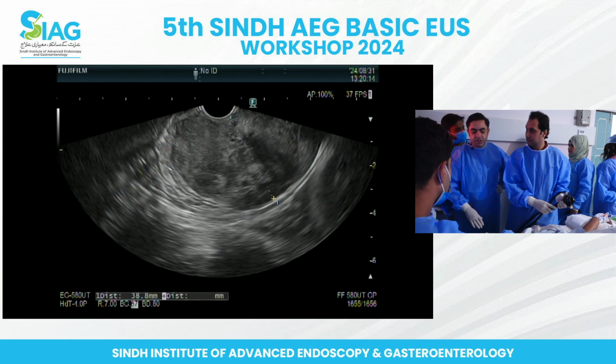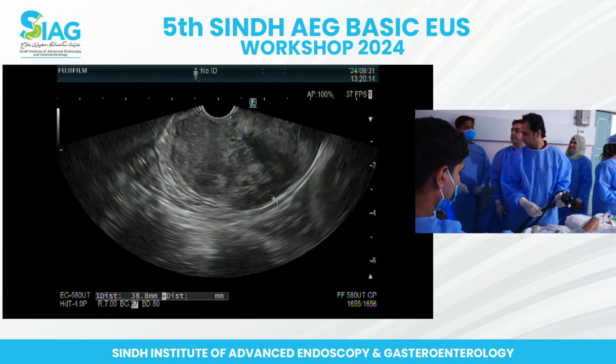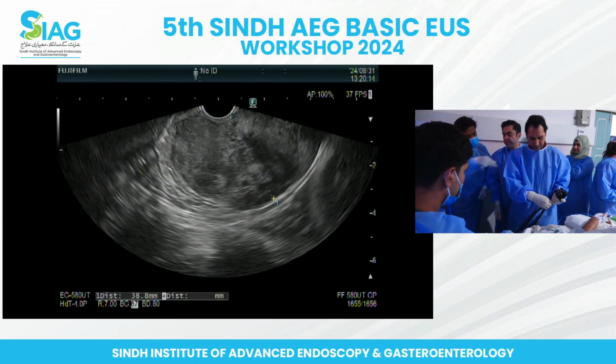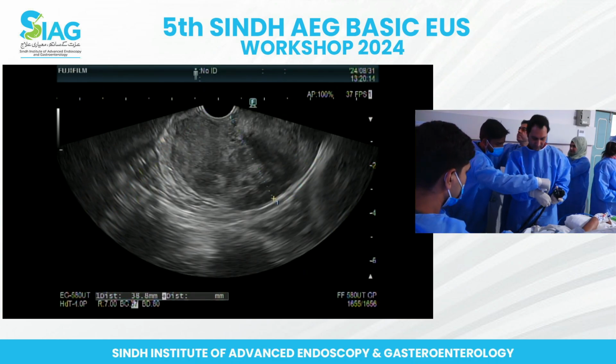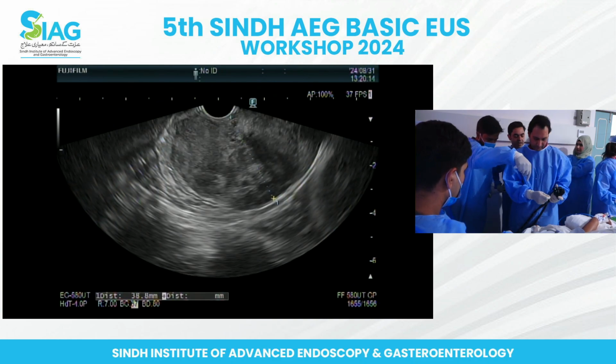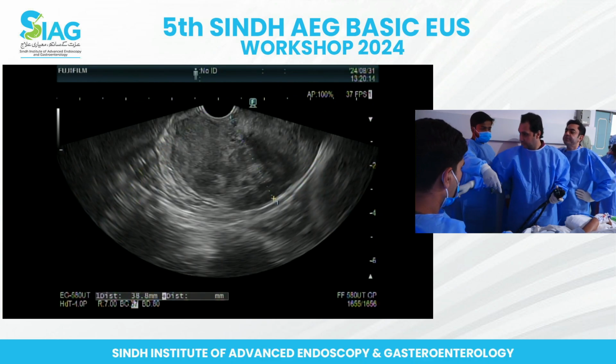So it's like 4 centimeters. Why don't you put... Shahzad, we can hear you again. So the other case did not start yet. Okay. So take it out and put it in. Yeah, so it's a 4 centimeter heterogeneous mass and it was quite soft when we put the needle in.